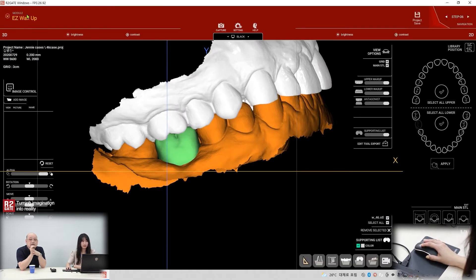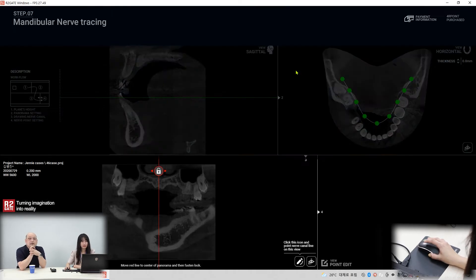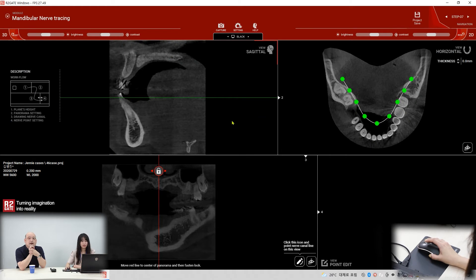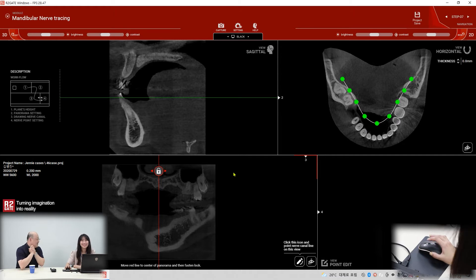And then multi — there's some mandible nerve drawing. I think this is a difficult part, but Jenny is a professional, so you can make it short. Very easy.